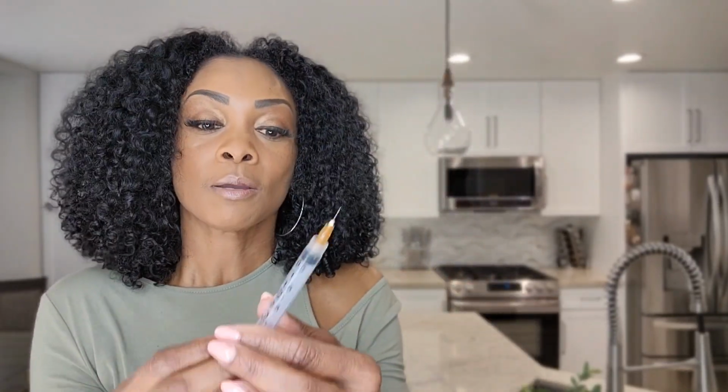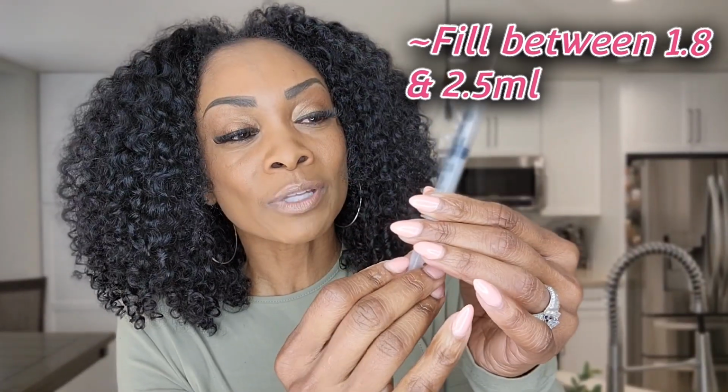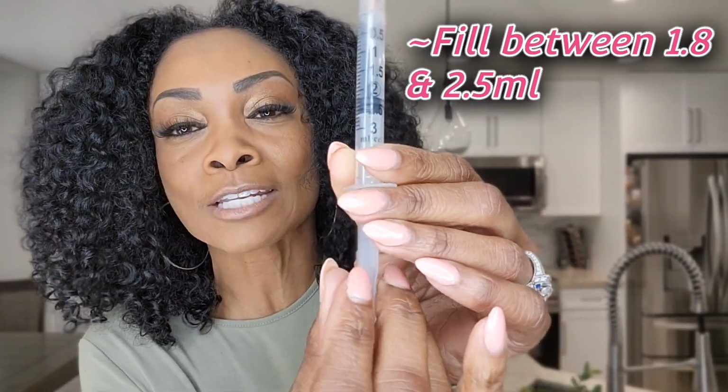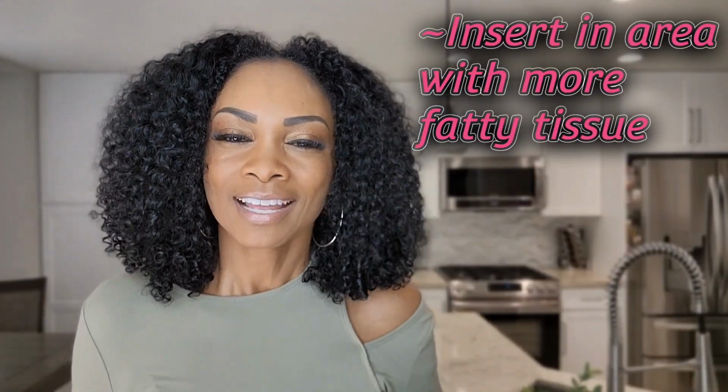So don't forget, if you're on the Tandem T-Slim X2, listen, make sure you are getting the air out of that needle first. And then when you're loading it with insulin, make sure you do not go past that 2.5. Very, very important. And last but not least, be sure to pick a fluffier spot. That way you don't have any insulin delivery issues later on.